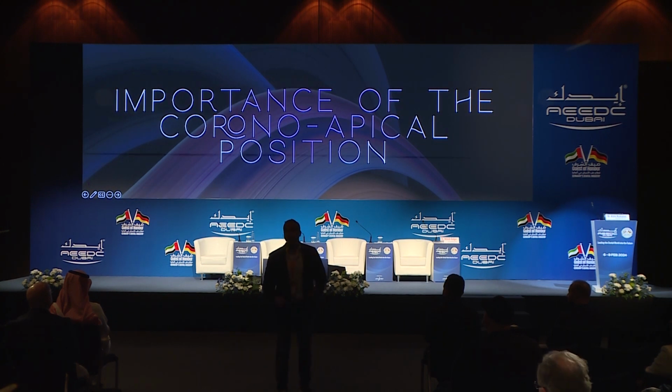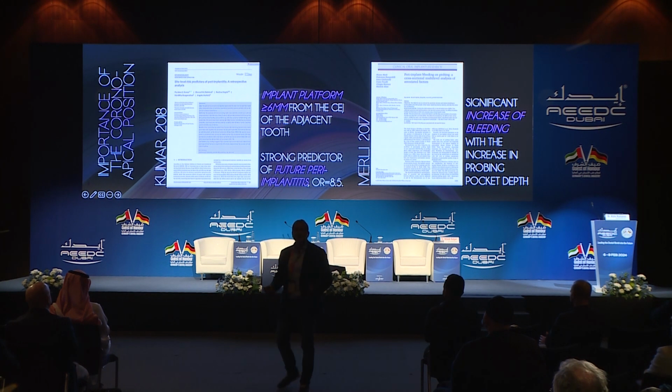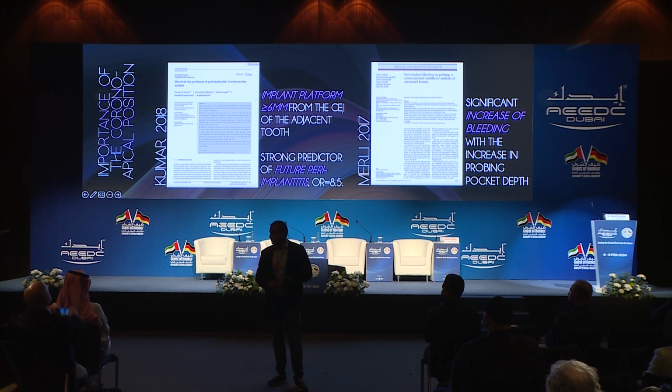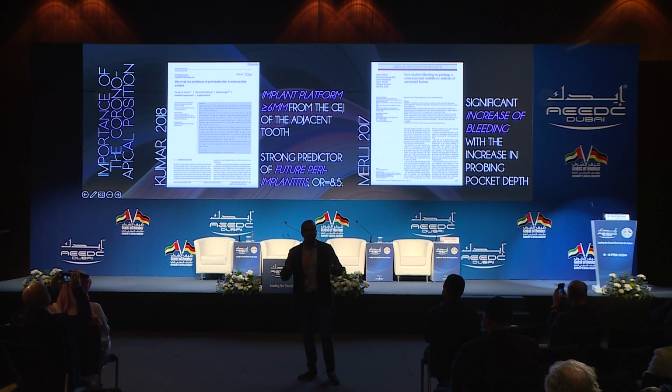So placing the implant in the coronal-apical position, my friend, well, there's strong evidence in the literature. The deeper you place your implant, the more complications you will have, whether prosthetically, imagine the jumping distance from an 8 or 9 millimeter implant to get the right abutment with the right profile.